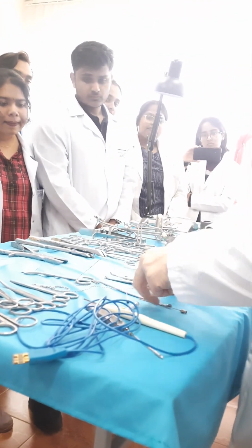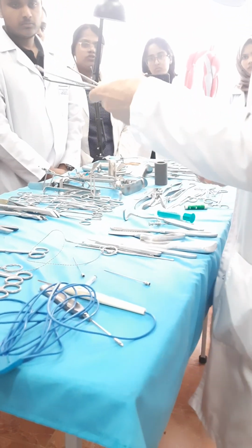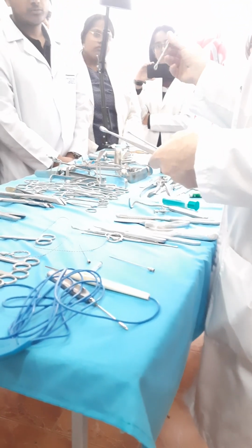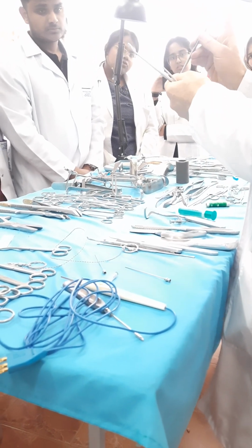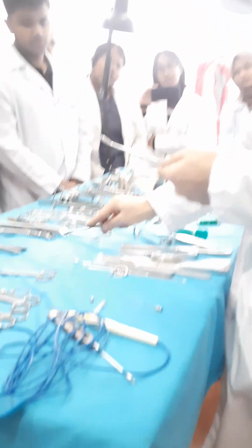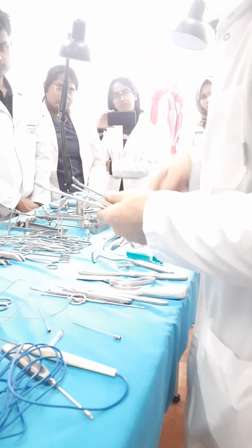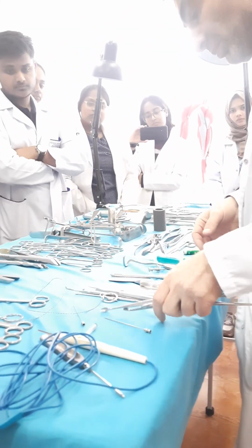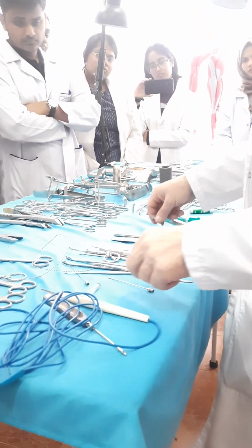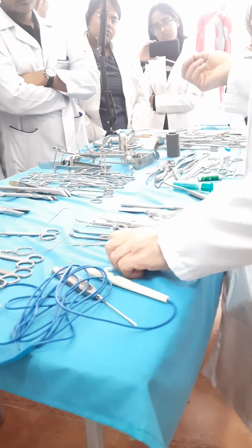Next instruments in group number 1, it is the bone spoon. Exactly this one, we call it Volkmann spoon. It has sharp margins, one side bigger, another smaller. You clean the bone cavities and the bone surfaces from pathological structures, from tumor up to pus. Next sharp instruments are different kinds of needles.